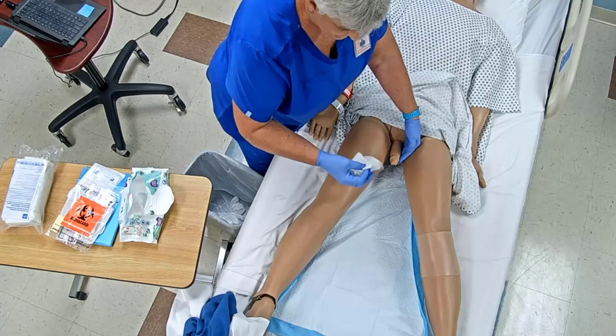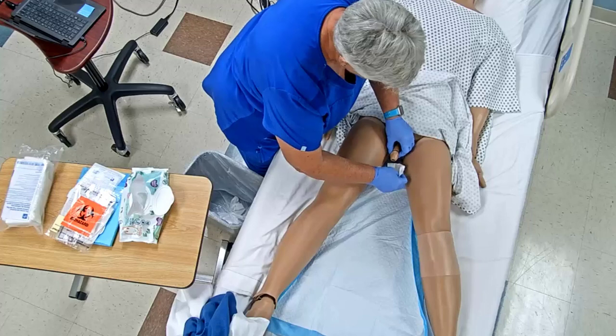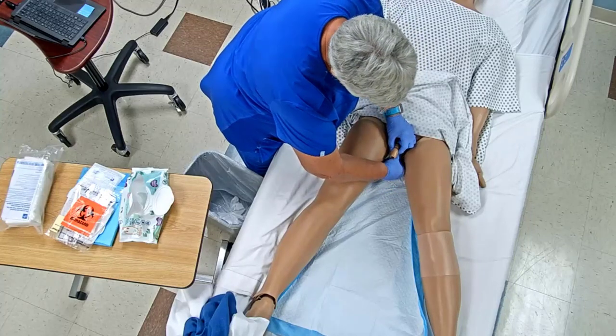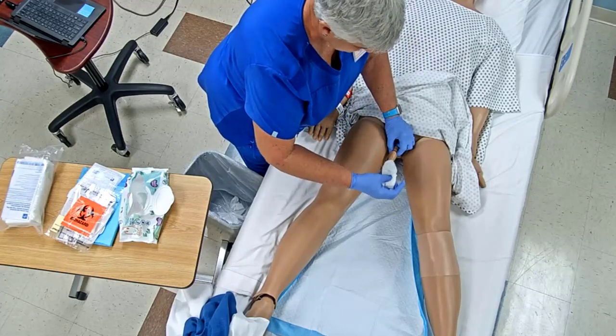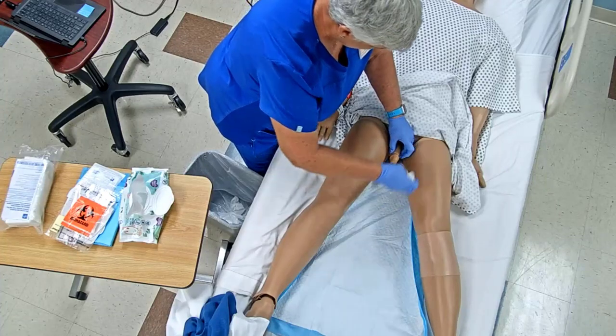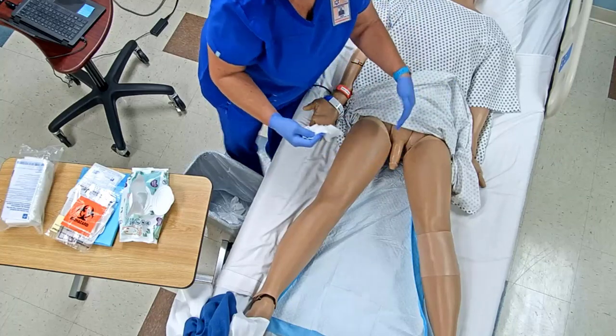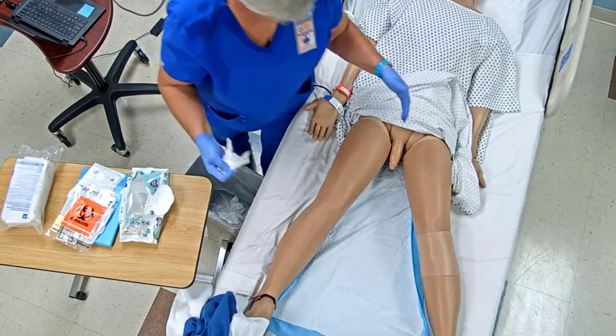And then we're going to do the same thing with this one. Okay, we're going to go down the back side, then we're going to change sides, and we're going to work from the side. So four sides of the penis. You want to use firm strokes.